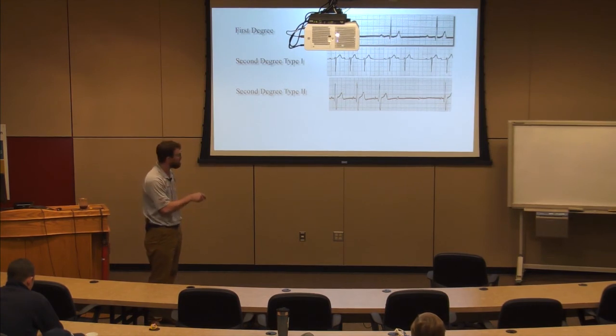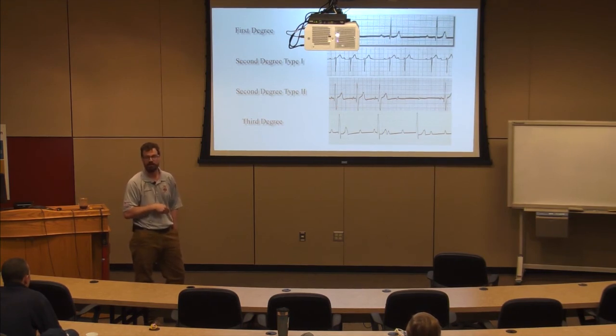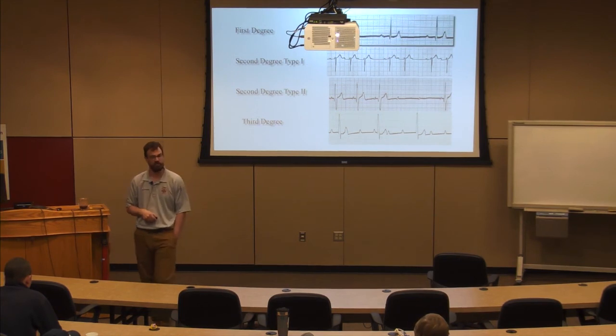So second degree type 2 is worse because it's so much closer to complete AV dissociation, like third degree block. And frequently you'll see second degree type 2 drop into third degree block.